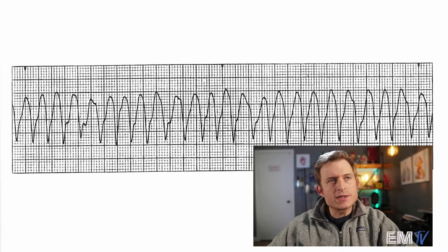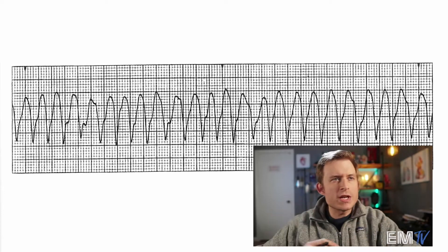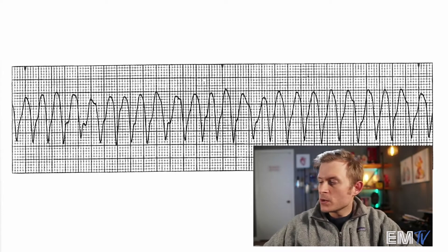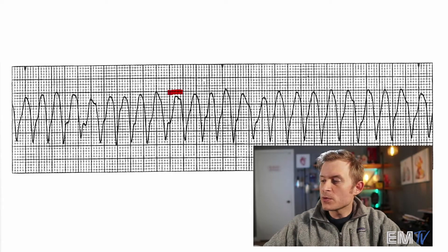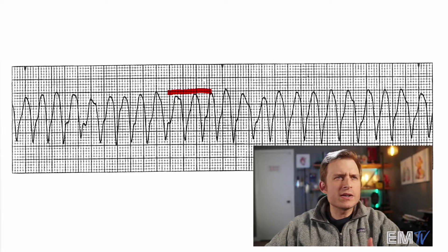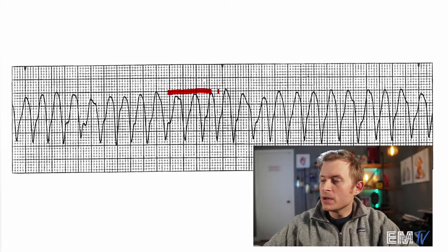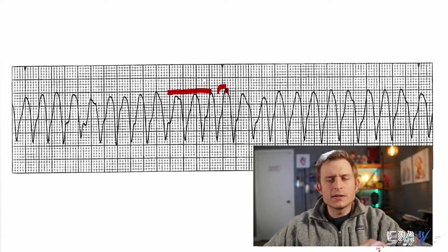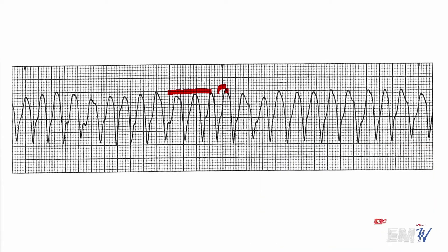Now I know a couple of you are wondering why isn't this a polymorphic VTAC — it almost looks like it's rotating a little bit like a torsades would. What you're seeing here is actually patient movement. The reason we know this is because the rhythm stays relatively underneath this reference line, but suddenly the rhythm is over the line, and underneath in certain areas. This leads me to believe it's caused by patient motion rather than actual twisting around the axis — that's why I'd call this one monomorphic. Let's look at the scenario and see if this patient is stable or unstable.